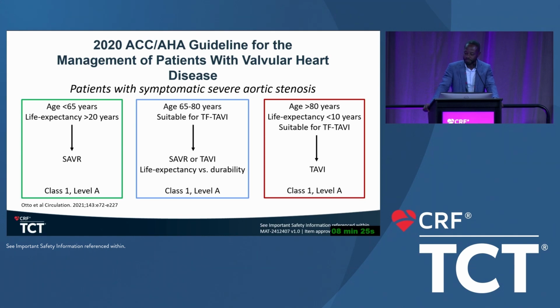I think why it's become important now is because the patients who come back to us with failing valves, that's when it becomes important. So I think more about commissural alignment when I'm treating a patient who's younger, who I think is going to need TAVR in the future, and their coronaries are potentially low or near the coaptation plane of my first valve, then I become a little bit more concerned. Other than that, we've been doing it for years. We've put in millions of valves without commissural alignment. We didn't even know about it.